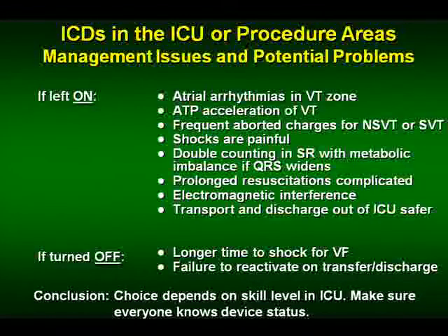Shocks are painful, and you can't time them. The defibrillator doesn't wait till you pass out. In metabolic abnormalities, the QRS can widen, and you can get double counting. So you can be in sinus rhythm and get shocks. Prolonged resuscitations become complicated because you never know what the defibrillator is doing.